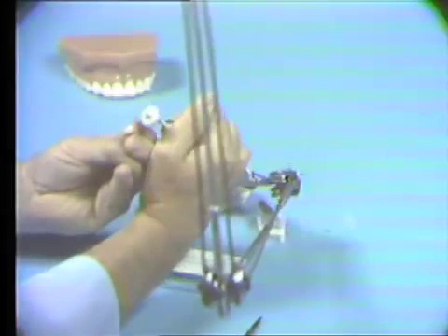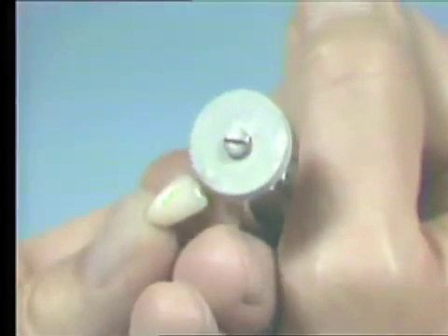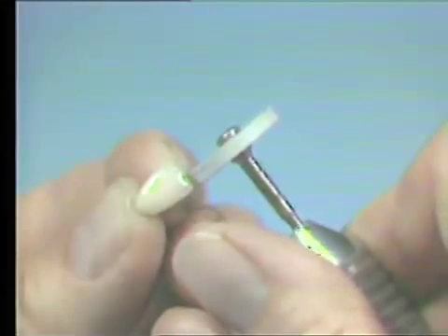When grinding the incisal edge, be sure to grind from the mesial to the distal aspect. If you grind the pontic from the buccal to the lingual, there is a tendency for the glass-like ceramic material to chip.